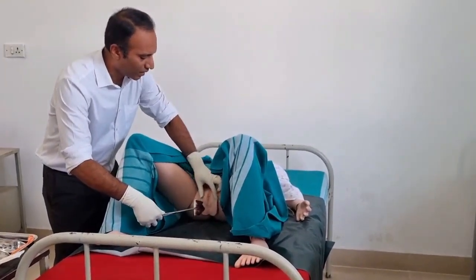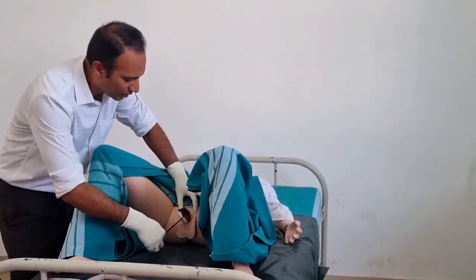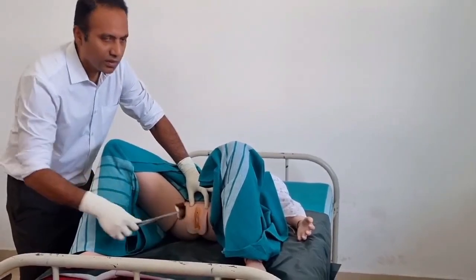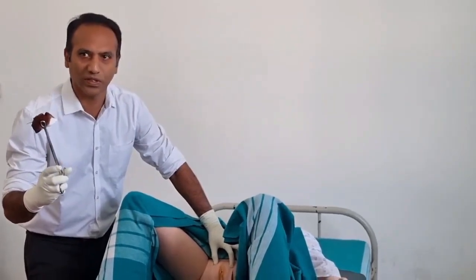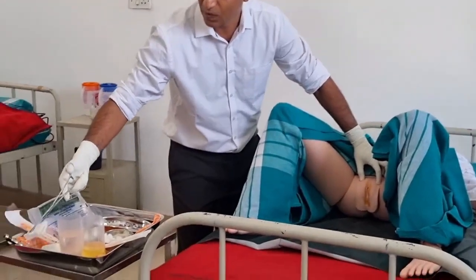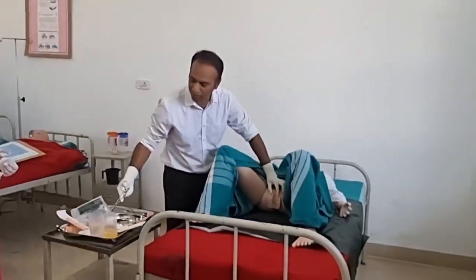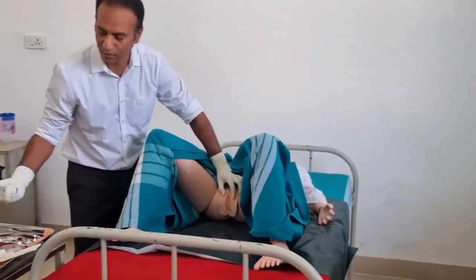First I will clean from the clitoris to the vagina in one stroke. Remember, each gauze is for one stroke; after that you do not reuse it. Second, with the non-dominant hand, I am widening the labia minora.